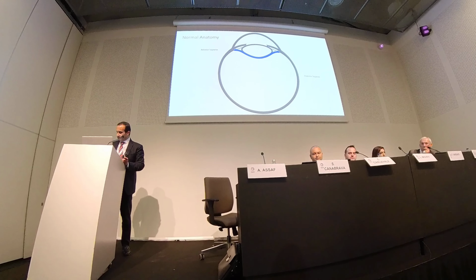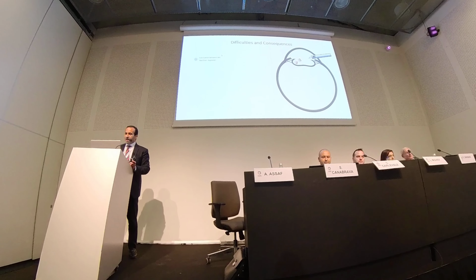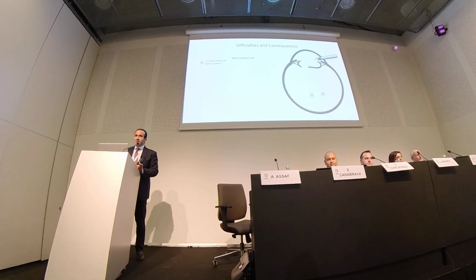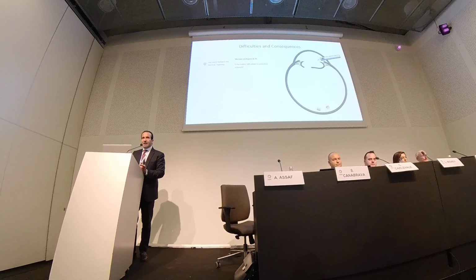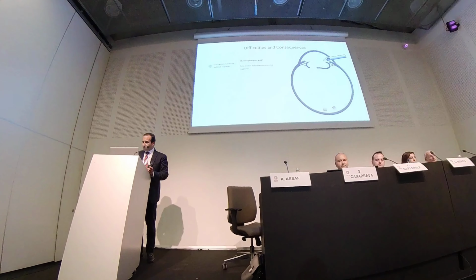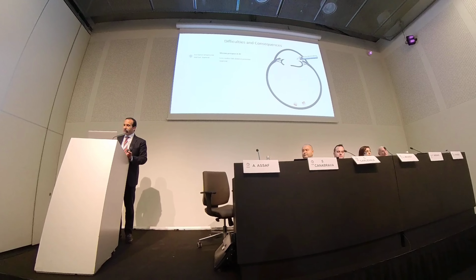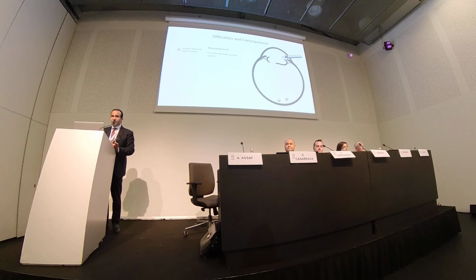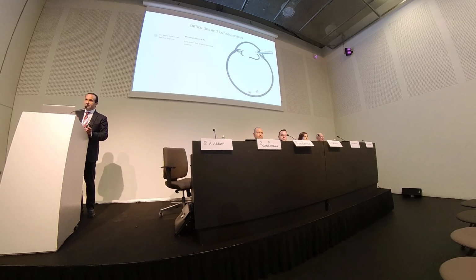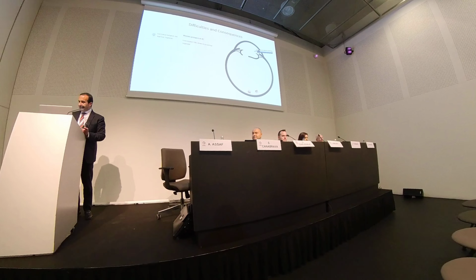For example, after losing the barrier, the vitreous might prolapse inside the anterior chamber, and the lens fragments might fall down in the posterior segment and complicate your surgery. So again, if you just pull out the phaco tip, this will invite more vitreous, and this more vitreous will put stress on the retinal periphery and might cause retinal detachment.